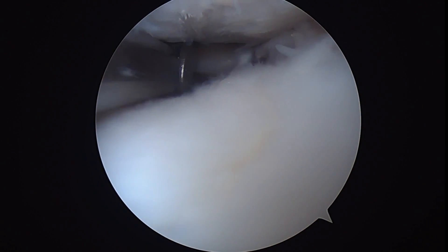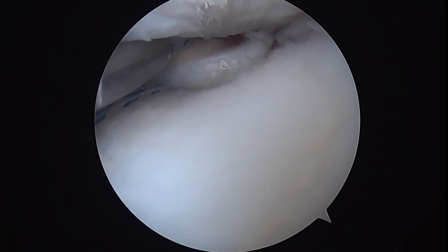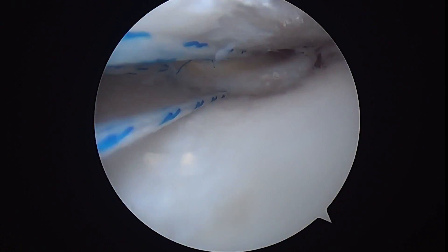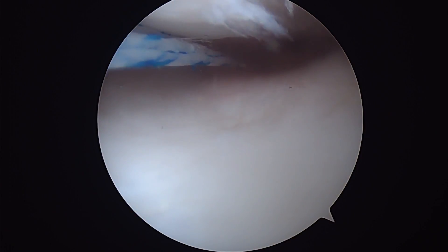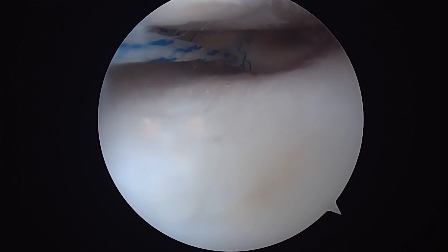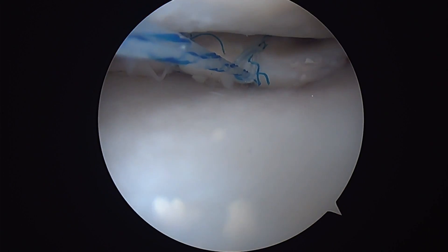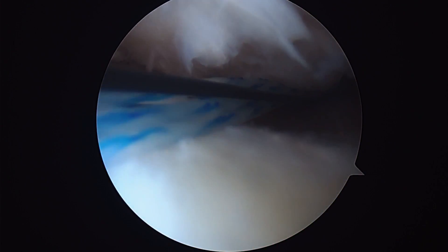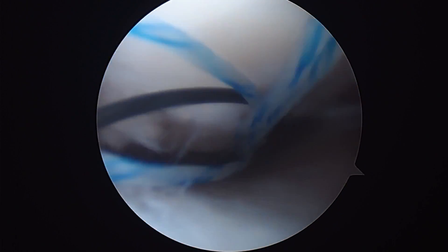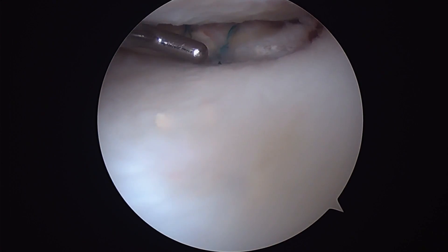The free limbs of the suture are then passed through the loop to achieve a purse-string configuration. A second purse-string suture is now being passed just medial to the first to provide secure fixation at the terminal end of the meniscus. After both purse-string sutures have been passed, control of the terminal end of the medial meniscus has been achieved. A standard ACL drill guide is then used to pass a guide pin exiting at the repair site, and a suture passer is utilized to pass the free limbs of the repair suture through the tibial tunnel. Traction on the suture is verified to fully reduce the meniscus at the repair site.